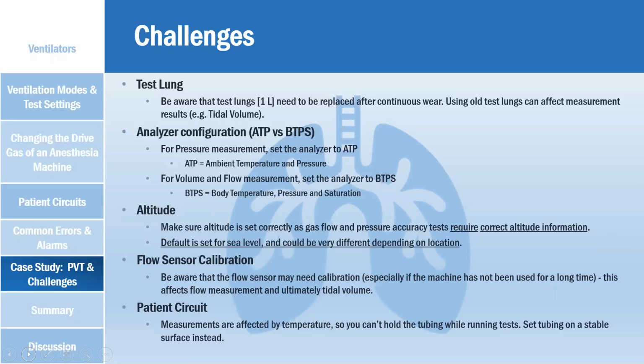Patient circuit, remember when you do testing, once you do the setting, all the connections should not use your hand to hold the particular patient circuit, because what happens is heat transfer can create resistance. For example, heat transfer on the pressure line circuit can increase the pressure. So normally when you do all these connections, you should not hold this particular connection. I think in most of the training in Cambodia, we did mention this part of it.